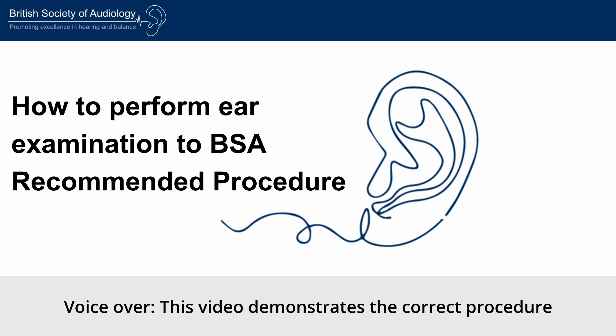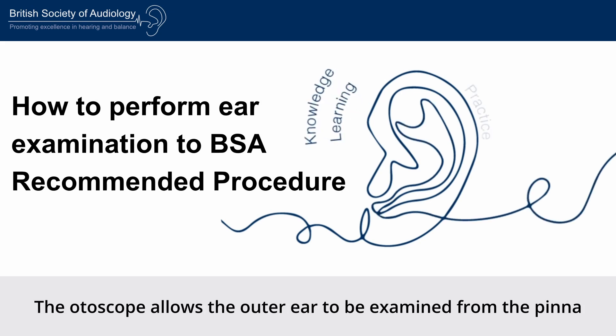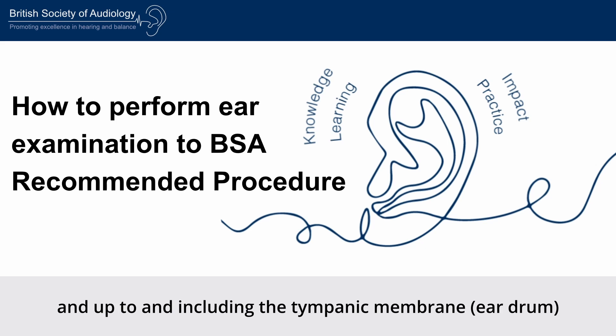This video demonstrates the correct procedure for using an otoscope. The otoscope allows the outer ear to be examined from the pinna to the external auditory meatus and up to and including the tympanic membrane.